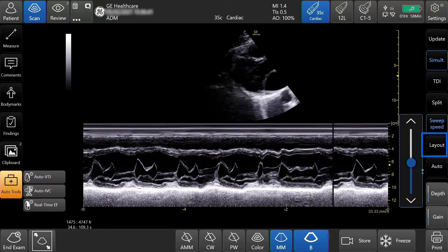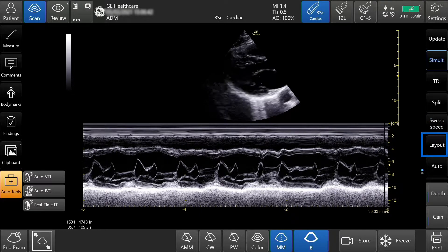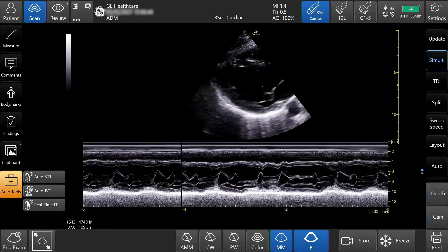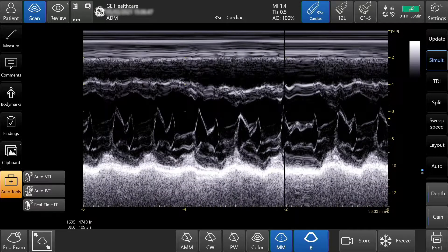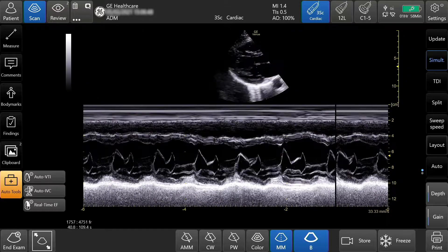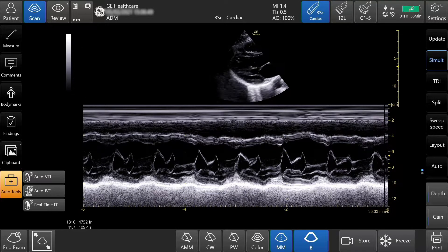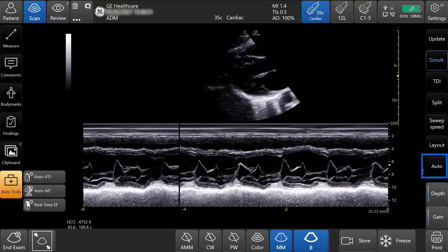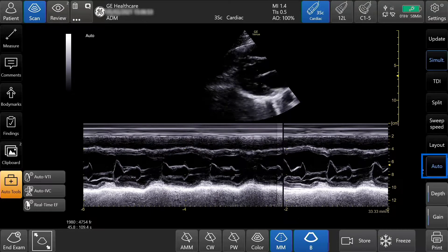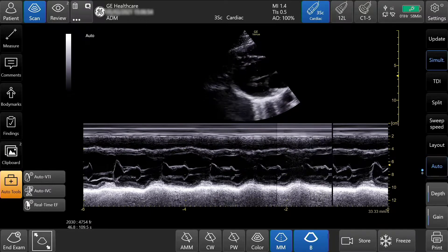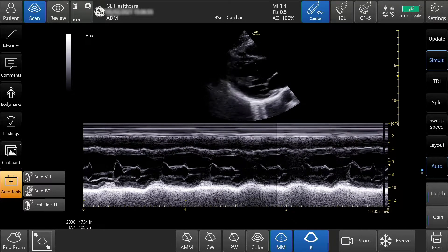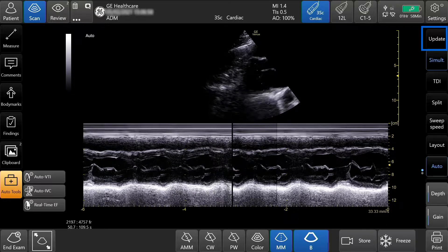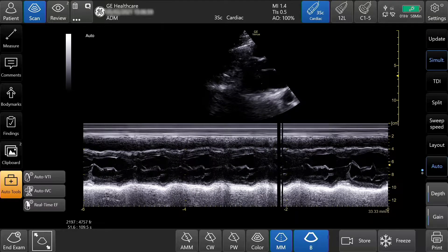Layout allows you to adjust the size of the B mode and M mode image. Auto-optimize optimizes the gain and contrast. The update tab toggles between the M mode and B mode image.